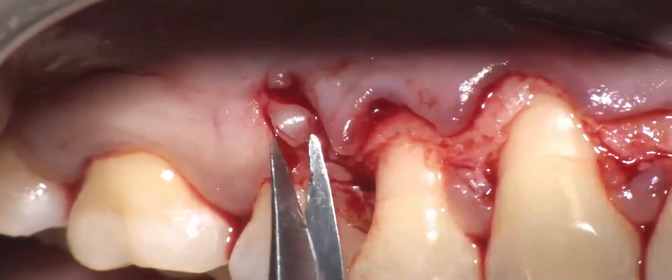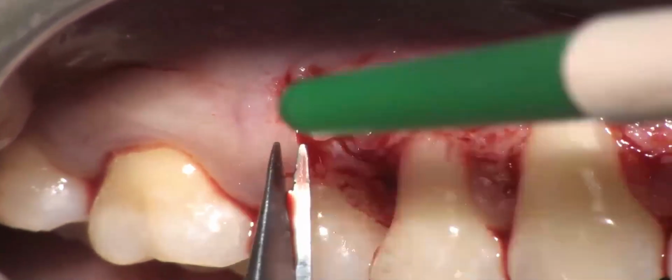Any sign of the vertical releasing incision.